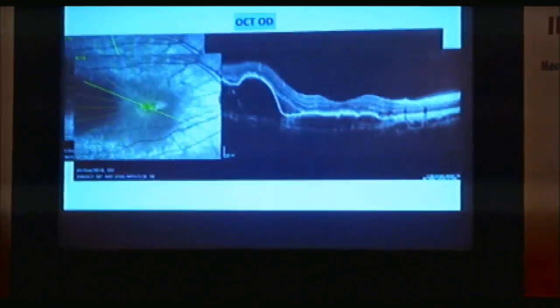It has a problem in the macular area. Yes, the macula is definitely involved. There is a PED. Yeah, and there's quite a thick choroid there as well. I mean, there's an increased thickness of the choroid, which I think we should be doing a lot more EDI, particularly in a normal retina.